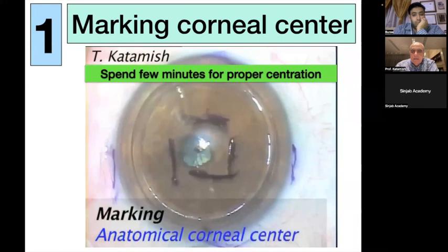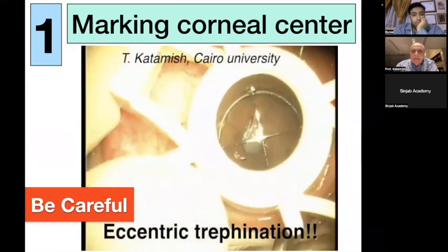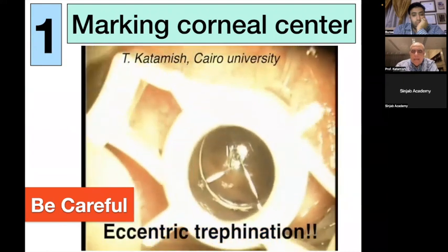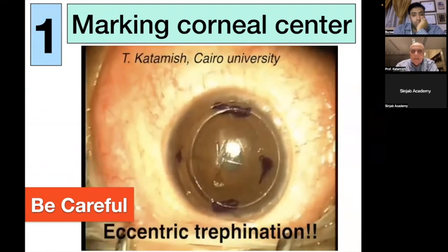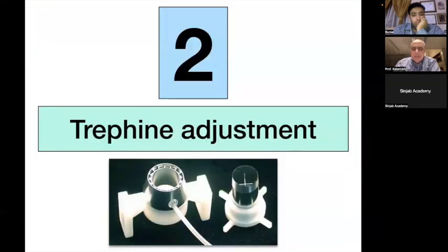Be careful. If you don't spend these few minutes for centration, you may end with this ugly, eccentric trephination. The second step, you have to make what I call trephine adjustment.